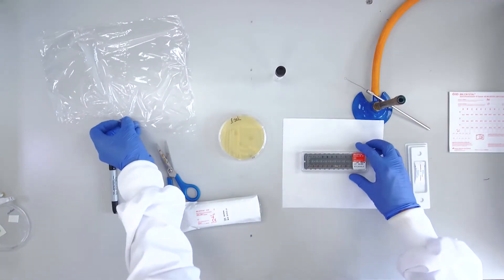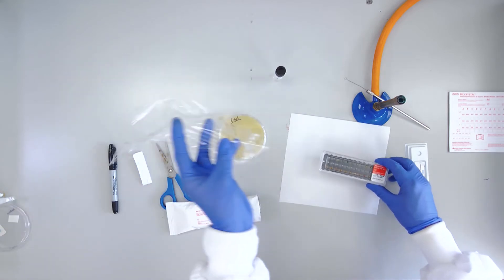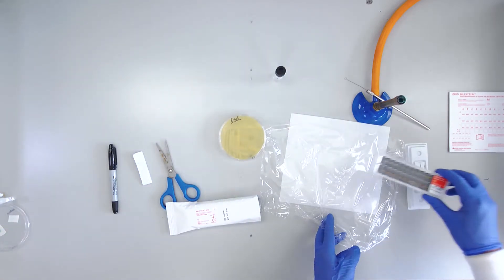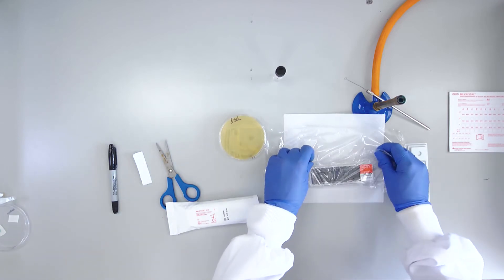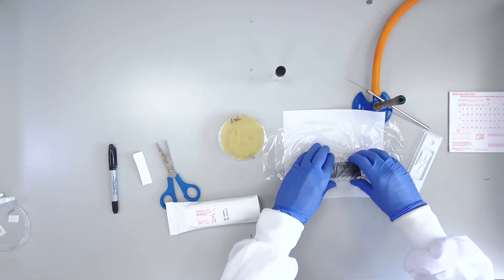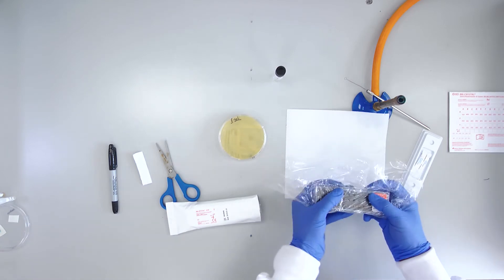The panel will then be wrapped in cling film to prevent drying out and placed in the 37 degree incubator with the label facing downwards for 18 to 24 hours.